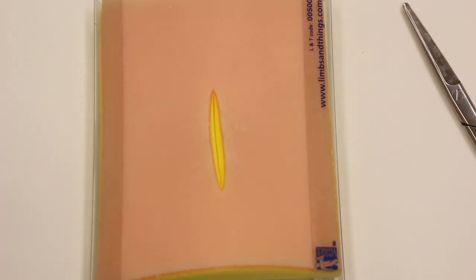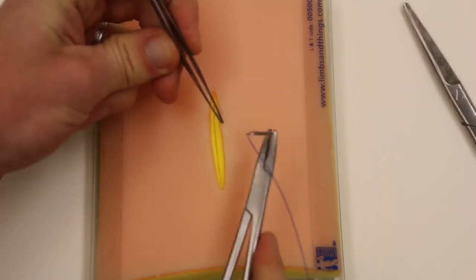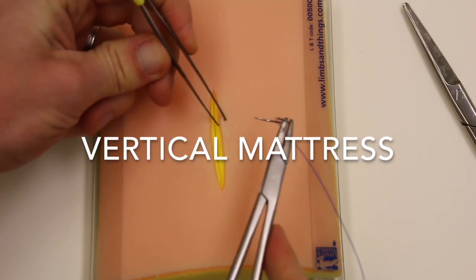Loading the needle in the same fashion. You're going to use these in cases where you're closing high tension incisions. So the outside of the knee or closing a fasciotomy would be common. First we'll show the vertical mattress.